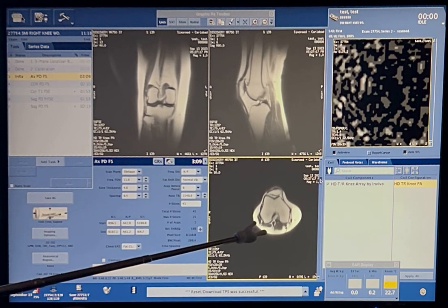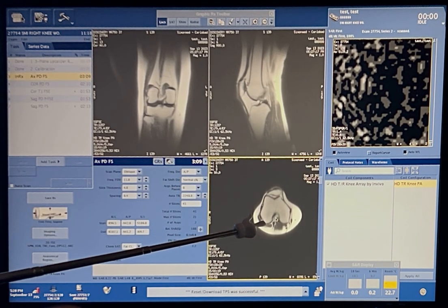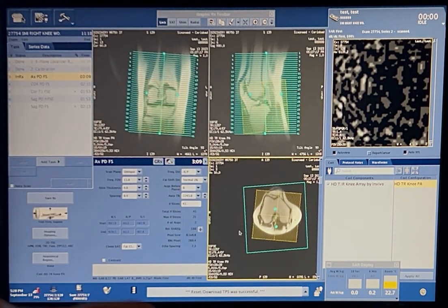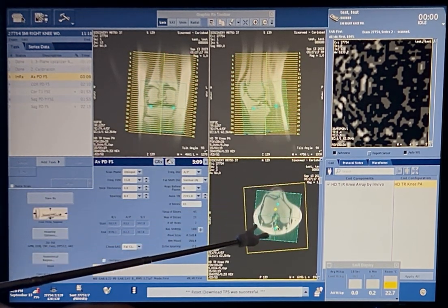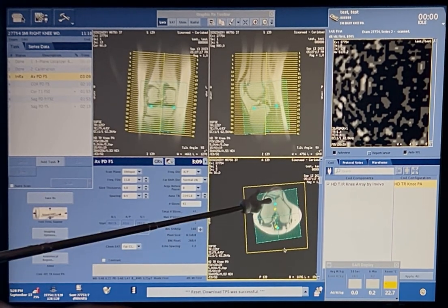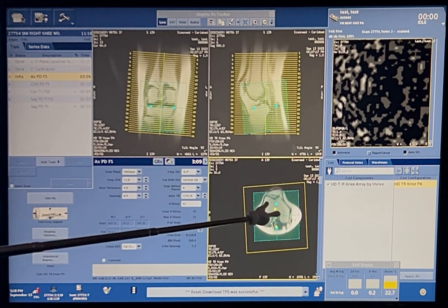Here we want to find the femoral condyles. So yeah, this is the money slice. You can see the medial and the lateral condyles. Actually, no, that might be lateral. Normally it forms like an L shape for lateral, but I thought it was this side, but this is likely the rounded side. So I believe that's lateral and this is medial.